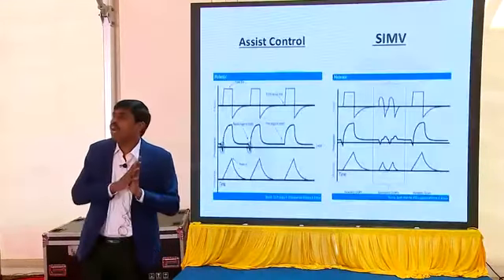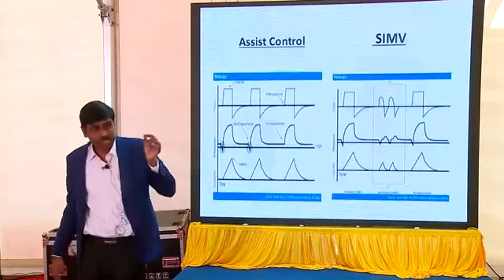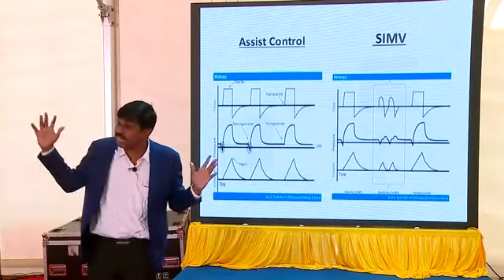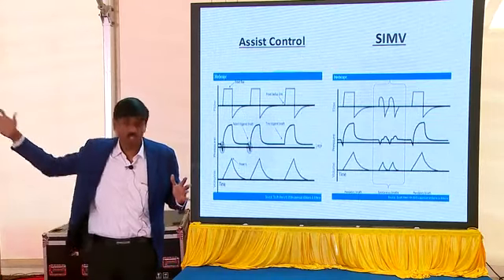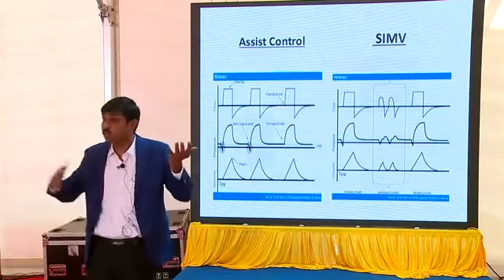Now, imagine you got a high volume unit where you ventilate 10 babies and you got one nurse handling 5 babies. A lot of water condensation in the circuit there. Now, each movement of the water droplets would be detected as a breath by the machine. So, what happens? It starts going haywire. So, you will have high rates there. But what's going to happen? Actually, it's not the baby's breath, but your expiration is going to get lesser and lesser. Now, you're going to have more and more air trapping. So, it's going to be counterproductive.